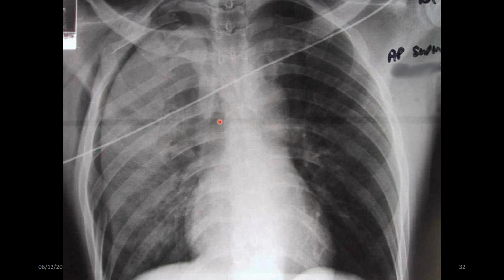Again, excuse the potato image. I can only assume it's what is called an AP supine. Very nice handwriting there. So this is an example of something called a flail chest. It probably looks more like a potato chest to the uninitiated. But down here you can see rib fractures.